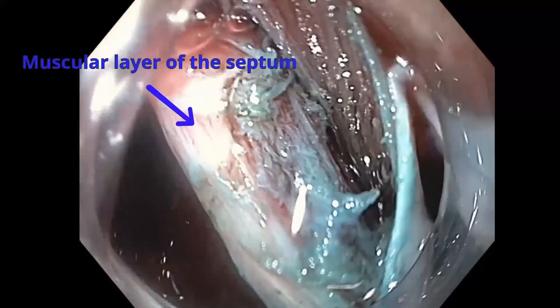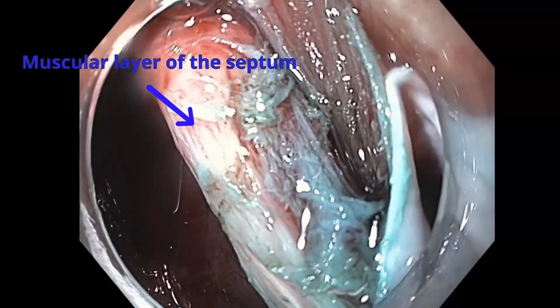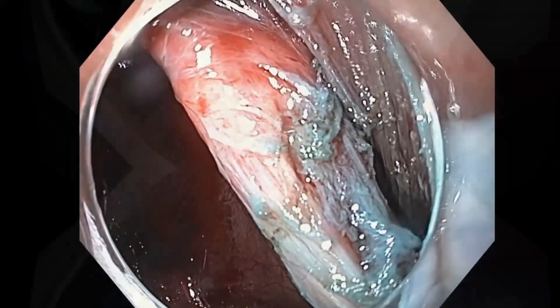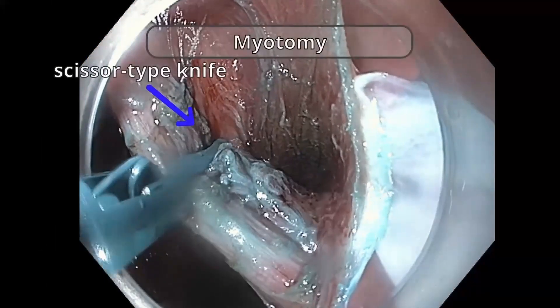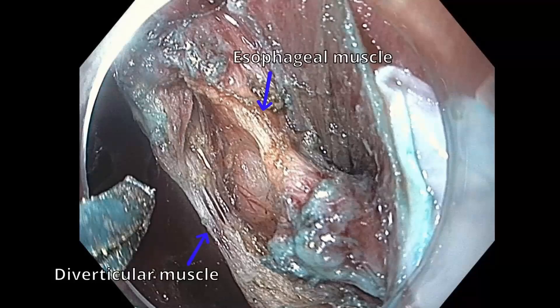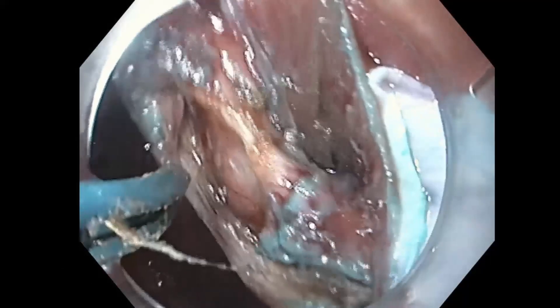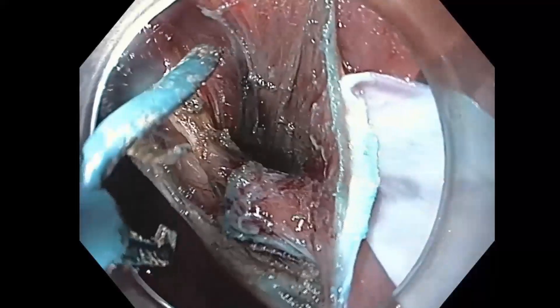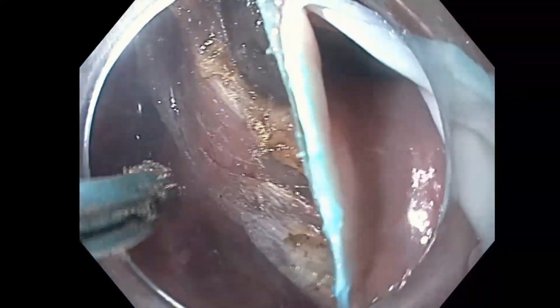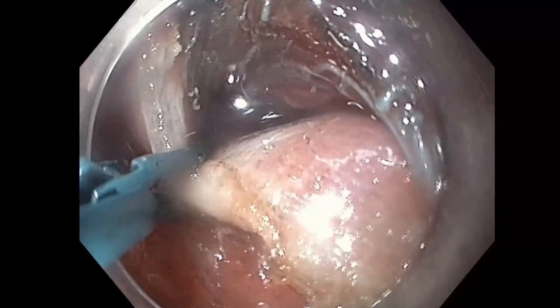The muscular layer of the septum is exposed and a myotomy is performed with a scissor-type knife. After the cut, the split between the Zenker's septum and esophageal septum is apparent. A complete myotomy of both diverticular and esophageal muscle is performed until the base of the prior Zenker's diverticulum is at the same level as the esophagus proper.